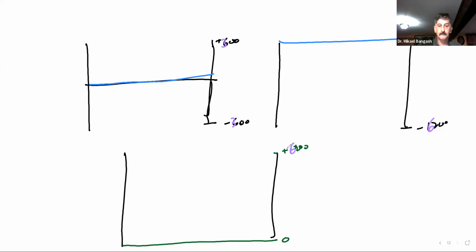So how can we increase these numbers? We can increase them from 300 to, let's say, 600, by increasing the PRF. Did that make sense?